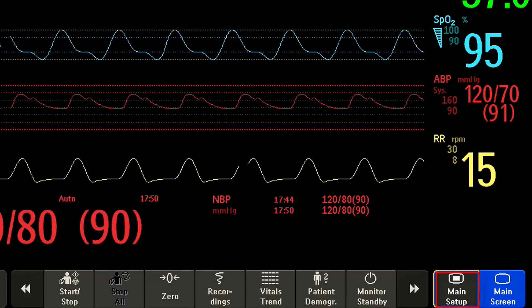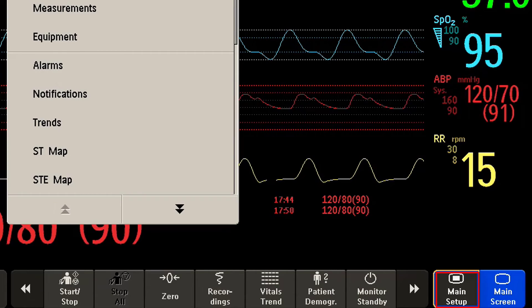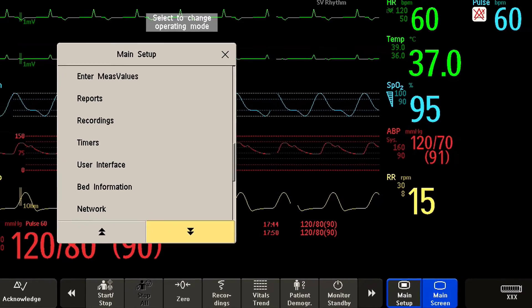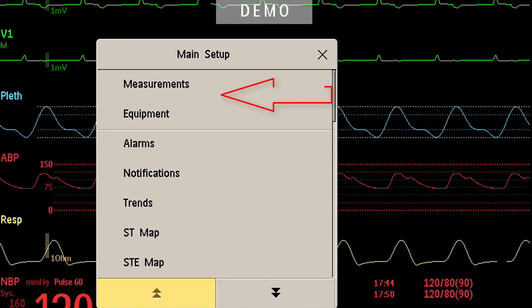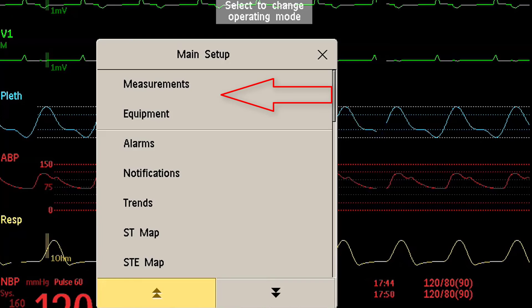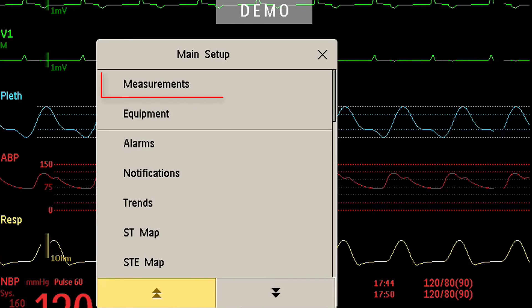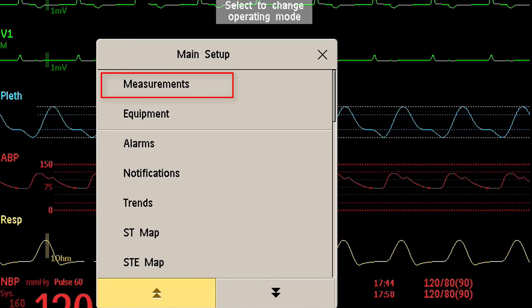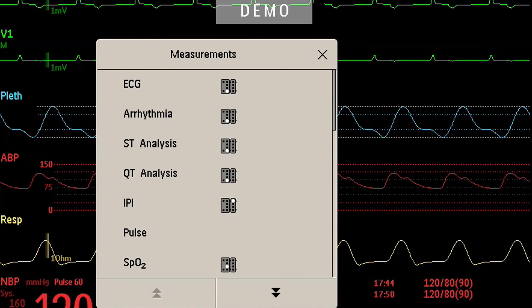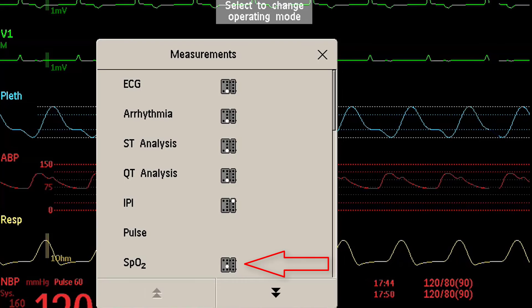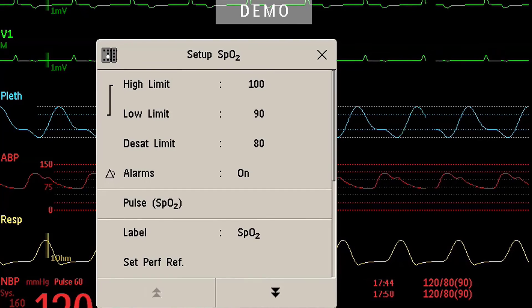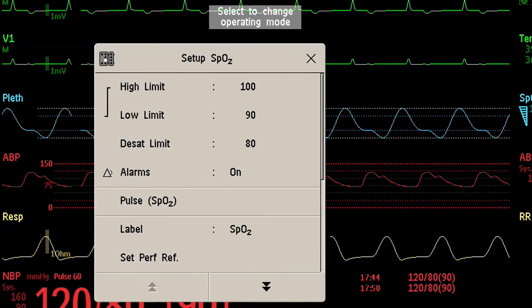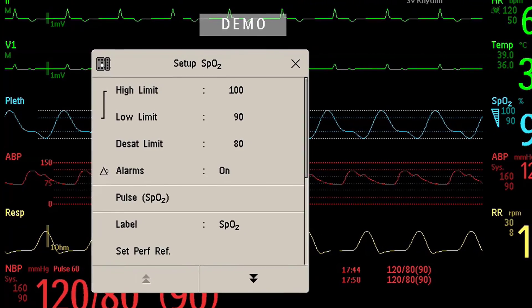The main setup key gives you access to all menus and functions in the monitor. The functions you need most are ordered at the top of the list. For example, under Measurements you will find all clinical measurements — such as SPO2, which is exactly the same menu shown earlier. There are many ways to access functions, and I'm sure you will figure that out quickly.